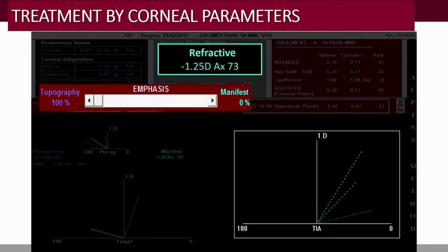As I mentioned, it can be perceptual, but also is what I call non-lens ORA. In other words, after taking out the lens, before you put the lens in, there still is a difference in the refractive and corneal values, which is going to affect your outcome, particularly for toric implants, because you might line it up with the cornea, but the patient, once again, might prefer the refractive value.